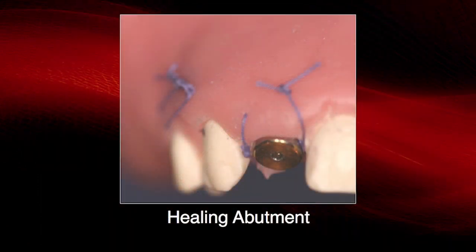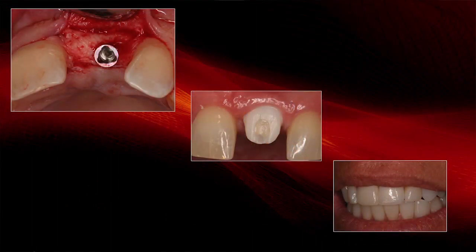Now, after healing, implant prosthetics is just unscrewing the healing abutment, placing an impression coping, taking an impression, taking a bite, and sending it to the laboratory. So here again you see an illustration of the flap design. It's more to the palatal side of the crest. So we're taking this masticatory keratinized mucosa and placing it more to the labial.